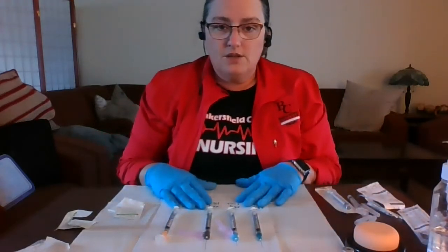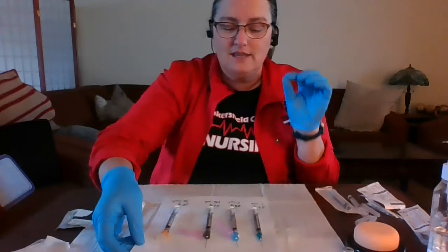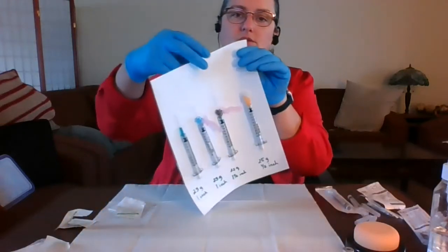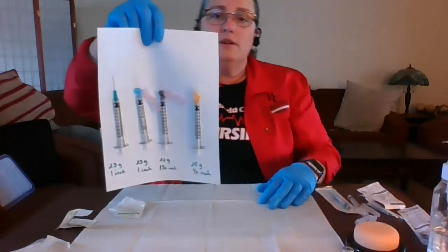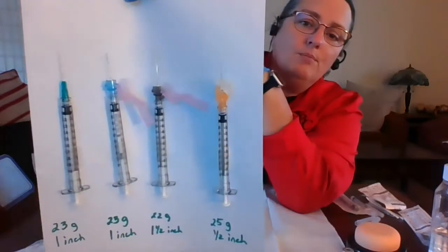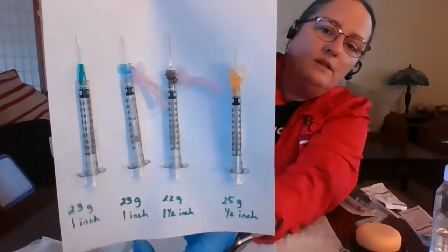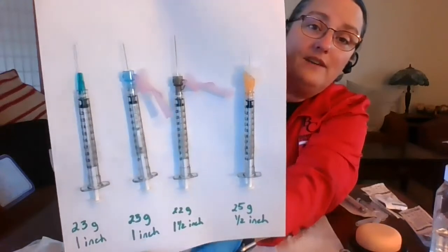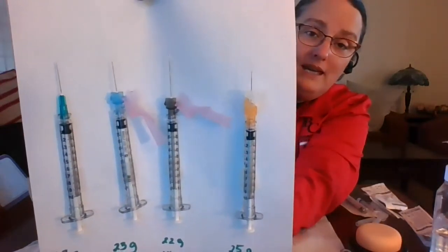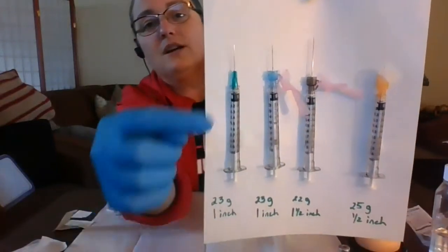So when we are giving an intramuscular injection, we have to think about the length and the gauge, which is how thick the needle is. When we are talking gauges of needles, the larger the number, the smaller the size. If I am going to be giving an injection into the deltoid, and I recognize that my numbers are backwards in my picture, I am probably going to be using somewhere between a 23, or possibly even a 22 or 25 gauge needle, because it doesn't have to be very big in order to inject medication into the muscle. What I'm showing you here is an example of what the needle sizes look like next to each other.